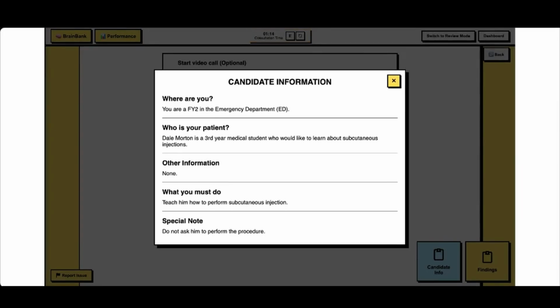So after that, before you put in the medication, the subcutaneous injection, make sure to clean the area. After cleaning the area, you can inject the medication. The way you do it, it's supposed to be at a 45 degree angle to the skin, making the planar area, it's like your 0 degrees, and the injection should be injected at a 45 degree angle.